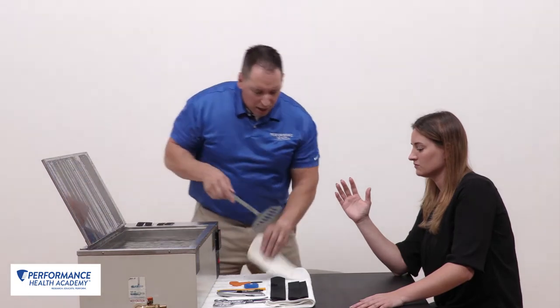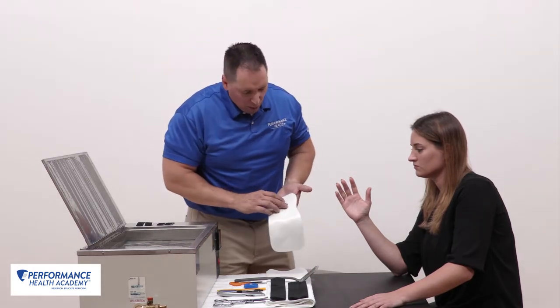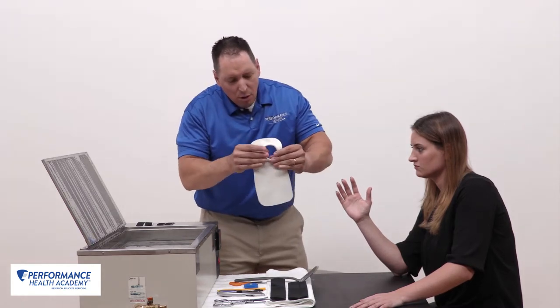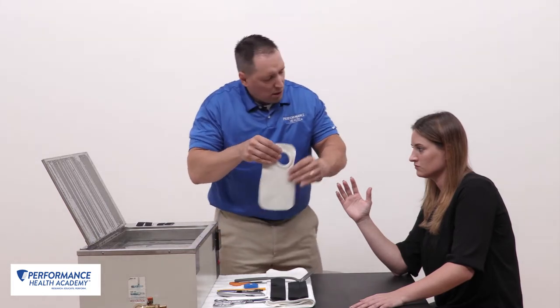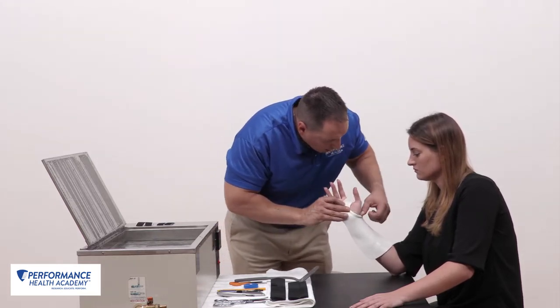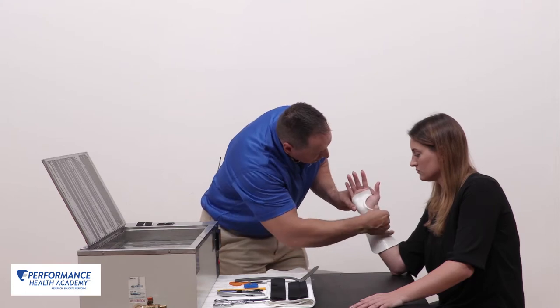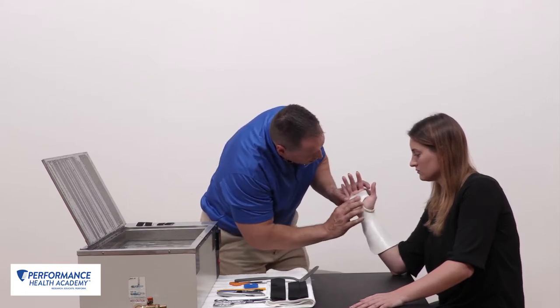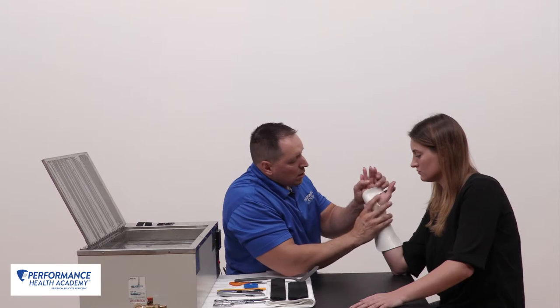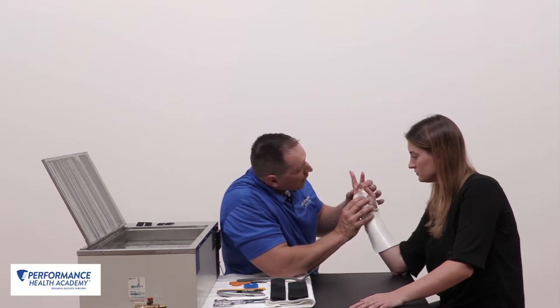Now we're going to use a pattern pre-cut for a wrist cock-up orthosis. Here's my thumb hole already prefabricated. I'll roll that orthosis opening out using polyflex, wrap the material volarly, open up the thumb hole, and apply the material. I gently caress the material and will need to trim it down below the distal palmar crease. I ensure the borders are high enough but not too low. Can you touch your small finger? — good.